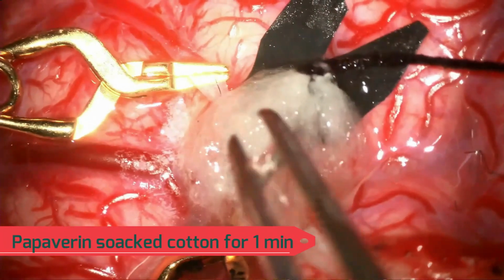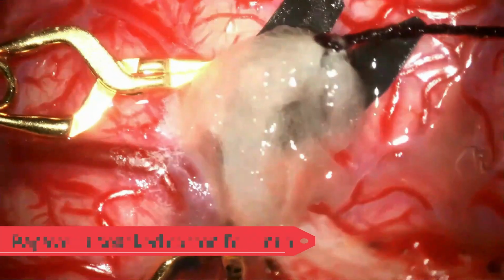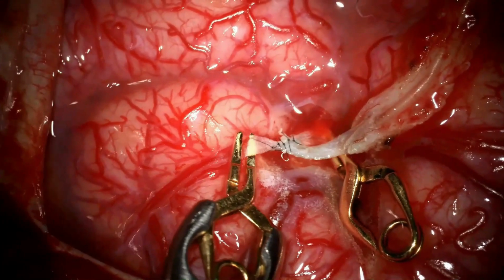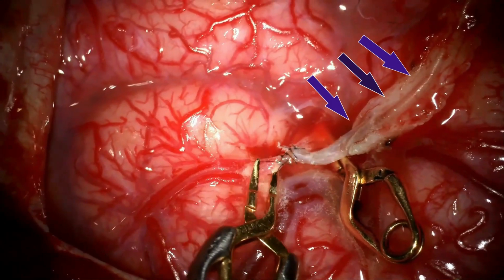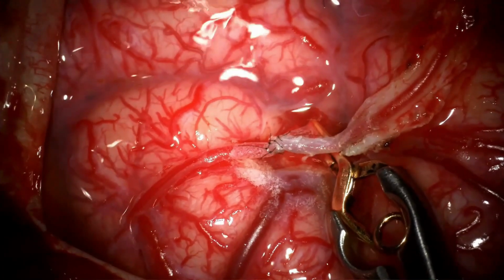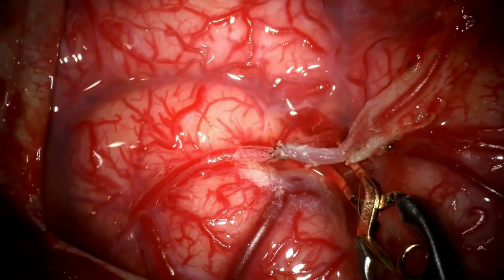Papaverine-soaked cotton is kept on the anastomosis for 1 minute. The distal MCA temporary clip is released first, and a gush of blood is noted traveling towards the STA, which is clamped proximally. Then the proximal MCA temporary clip is released.